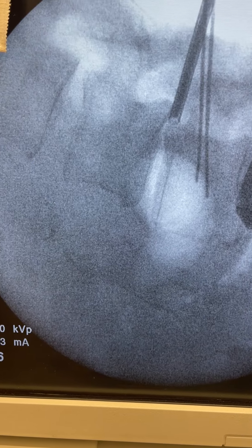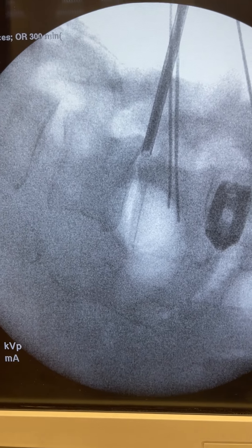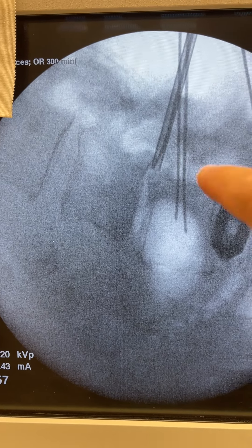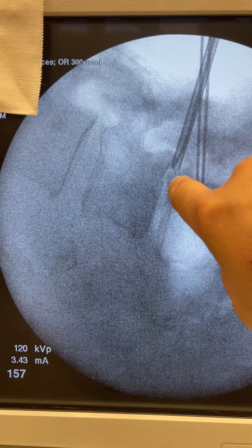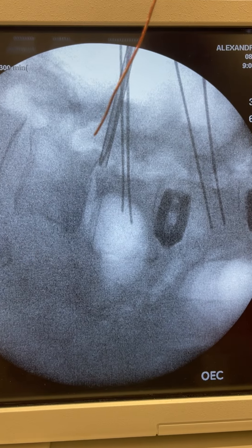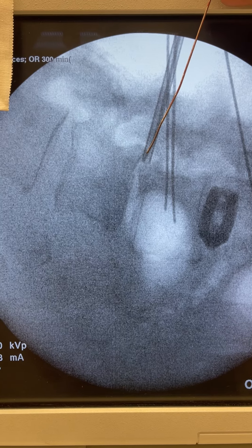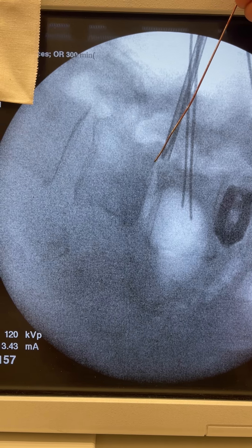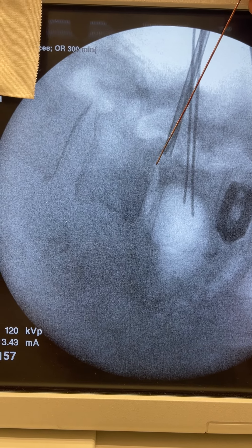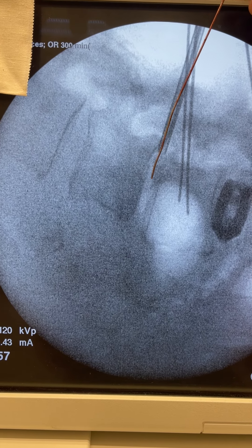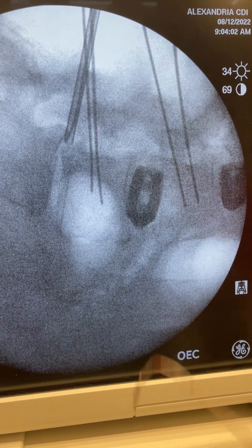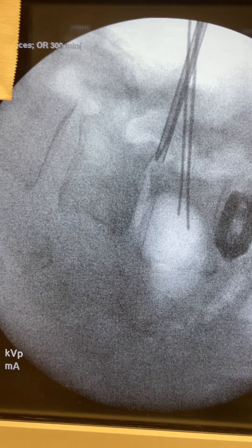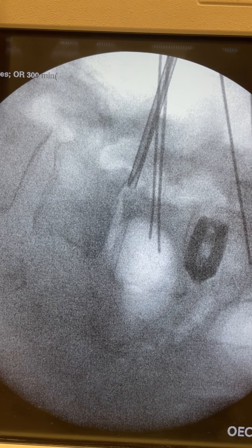To put the K-wire in — actually look at the K-wire coming in and hitting the bone. I put a small little bend in the K-wire, and I entered it, turned the direction, and then approached it more. That is the way to get that in — sometimes put a small little bend to enable us to pass that corner.